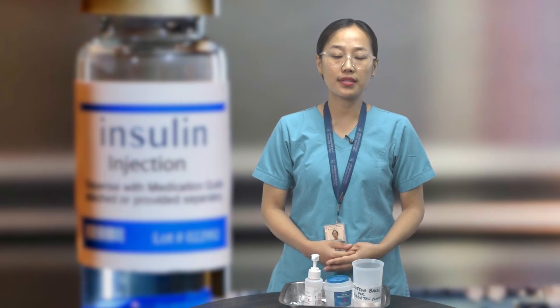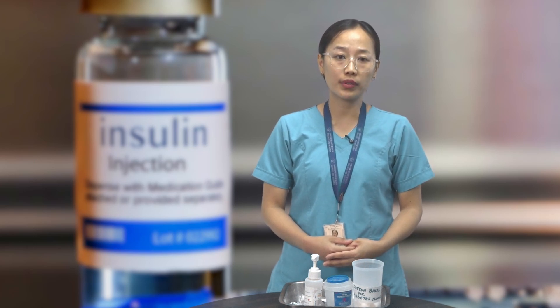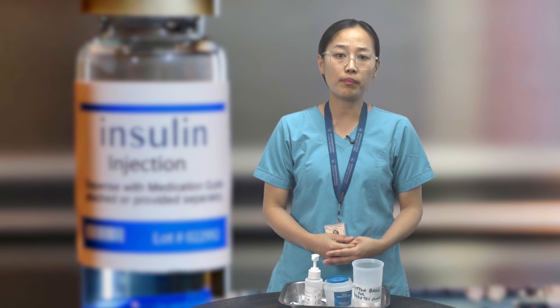Hello everyone, my name is Nyanbini, and in this video I will demonstrate the proper technique for administering insulin using both an insulin pen and an insulin syringe.